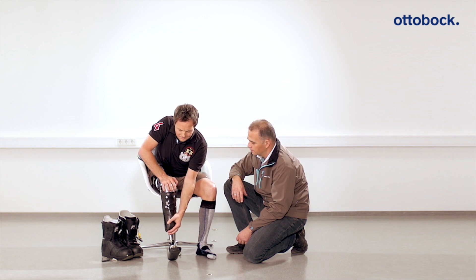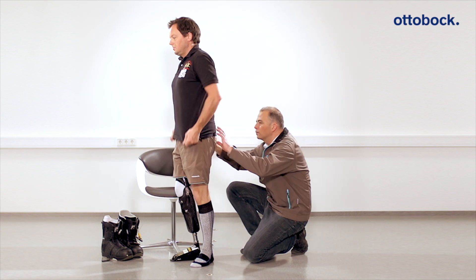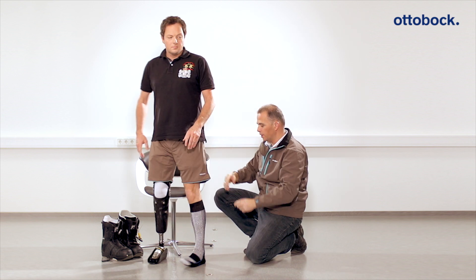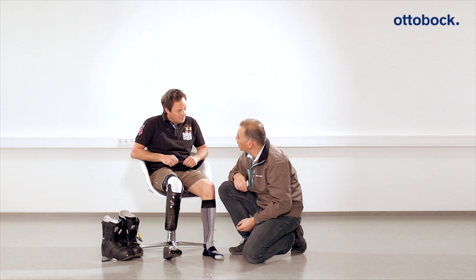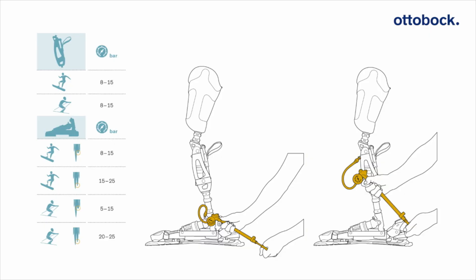The prosthesis should be put on while sitting to make it easier for the patient. Then check the height of the prosthesis — it is advisable to make the prosthesis the same length as the contralateral side. For adjusting the hydrodynamic system, the flexion resistance can be adjusted with the help of the high-pressure air pump. The preset values are merely basic values that need to be individually optimized for every athlete.